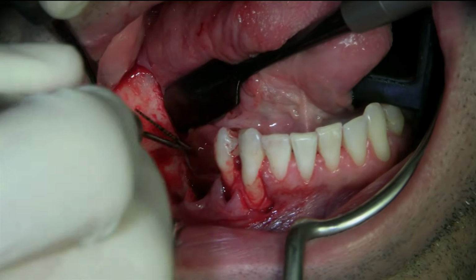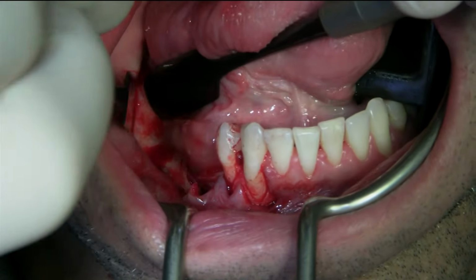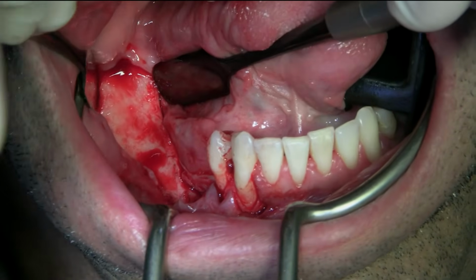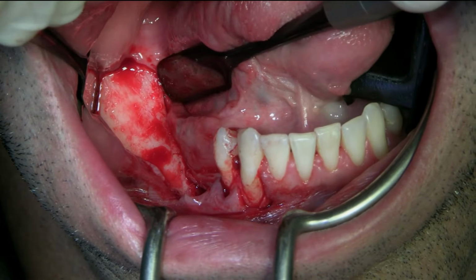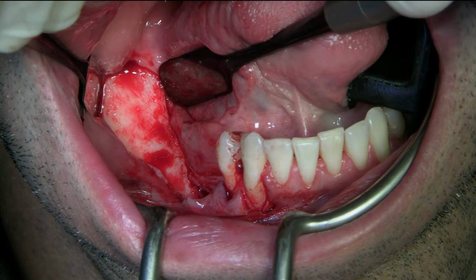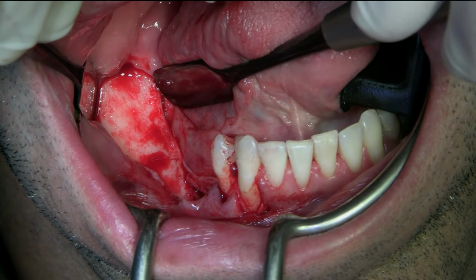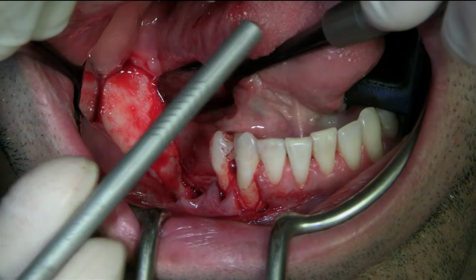I can start harvesting some bone here. And we'll take the bone scraper. So 30 by 40 and 40 by 50. So let's start with a 30 by 40, yeah. I need a larger bone scraper. So this here is the micros.